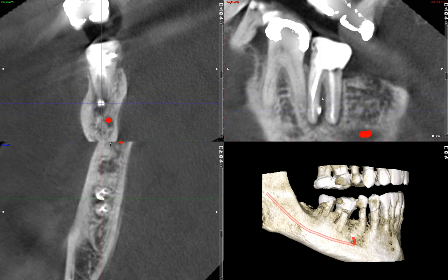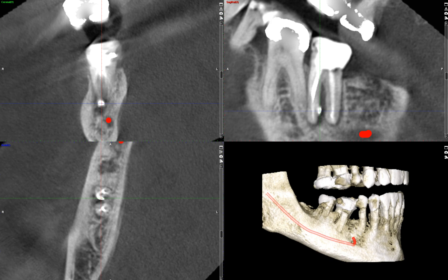So we have a lot of bone loss and extruded or separated filling material. What are some possible clinical scenarios? One possibility is that there may have been a root perforation from endodontic treatment, and that perforation may have led to this bone loss.